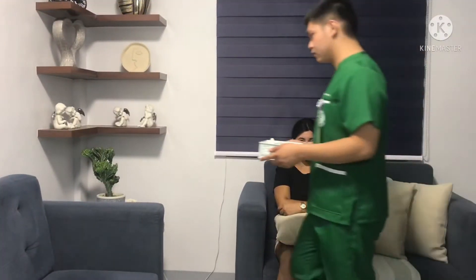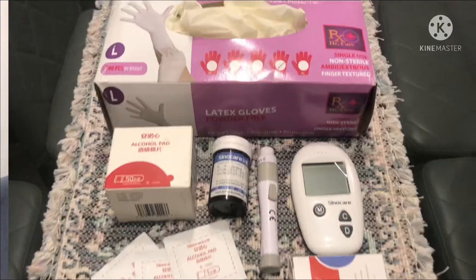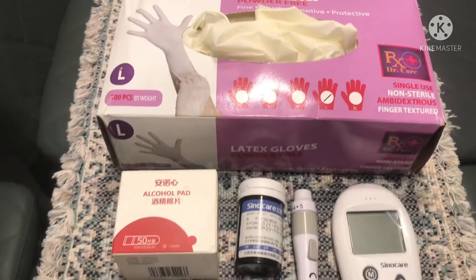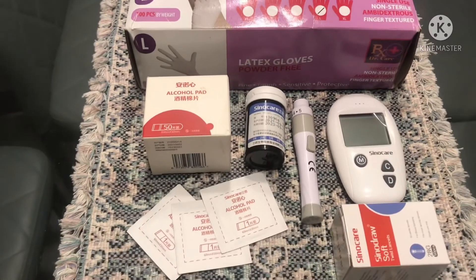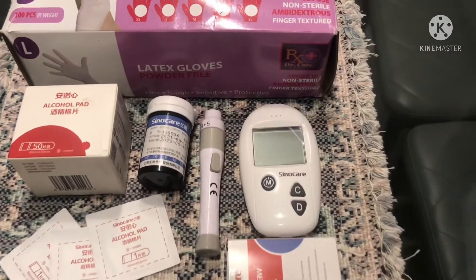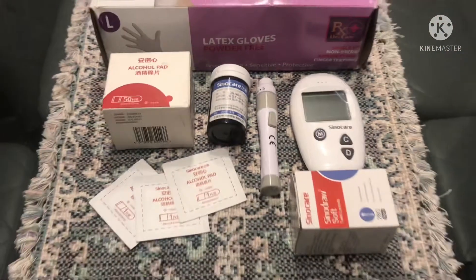Gather all the supplies needed, such as non-sterile gloves, alcohol swab, lancet, cotton balls, reagent strips, and a blood glucose meter.